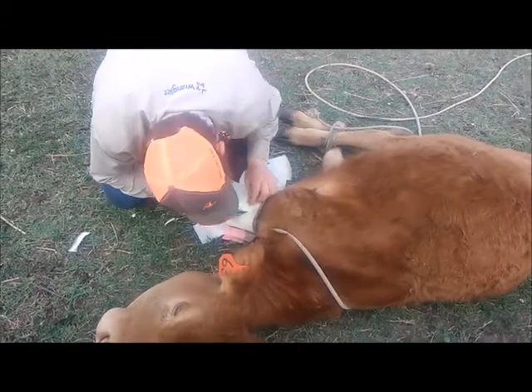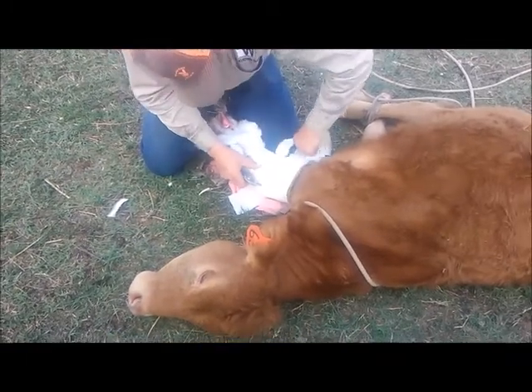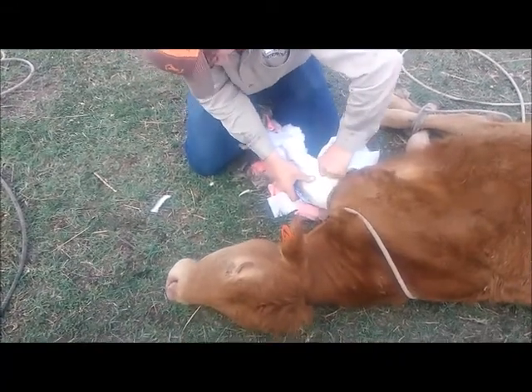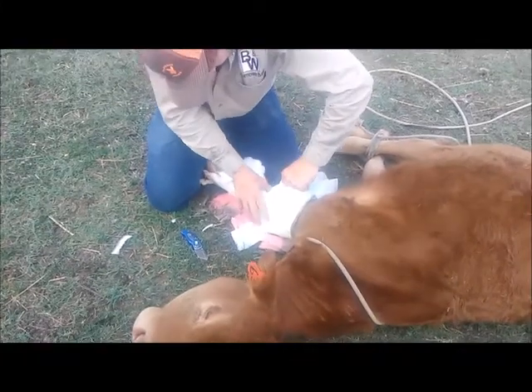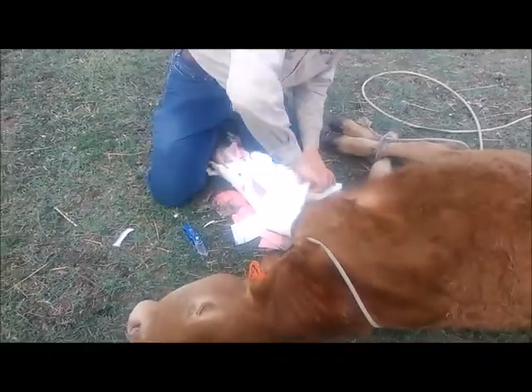And this went on April 19th, somewhere about. So the middle of April, and this is the end of June. So it's been six weeks or better? Should be closer to eight, because we had all of May and almost all of June, so it's closer to eight weeks.